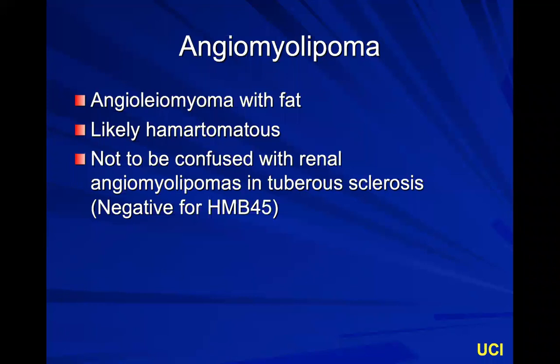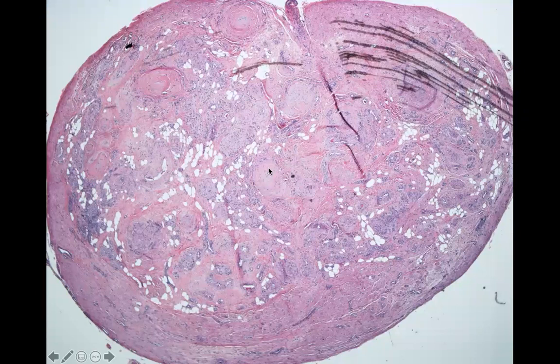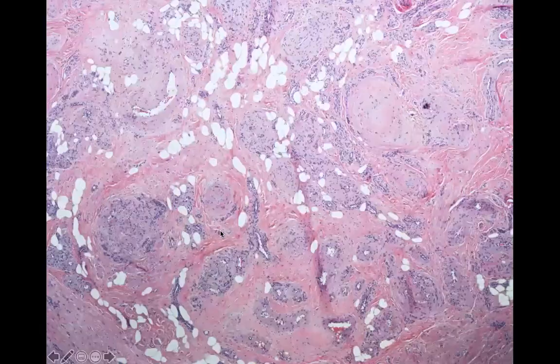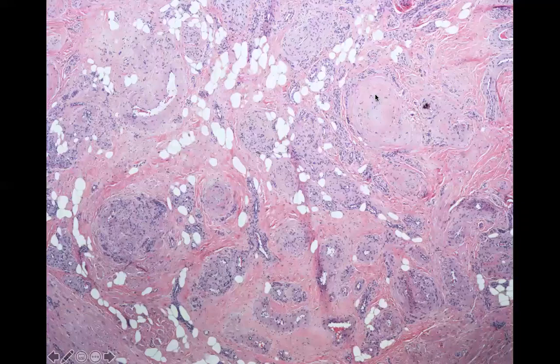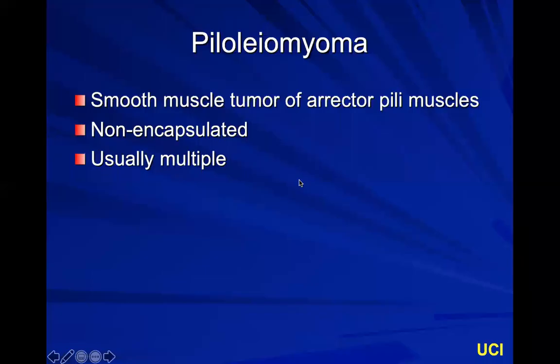An angiomyolipoma is essentially an angioleiomyoma with fat, and it's likely a hamartomatous tumor. Don't confuse this with renal angiomyolipomas of tuberous sclerosis — those are different tumors with the same name. Here again is your pink nugget. The tumor spins off crack spaces (blood vessels), and you also see fat in between. Up close, some nuclei are cut side-to-side giving cigar shapes, others are cut cross-sectionally giving circles, and the little white vacuoles — glycogen snacks — confirm smooth muscle.